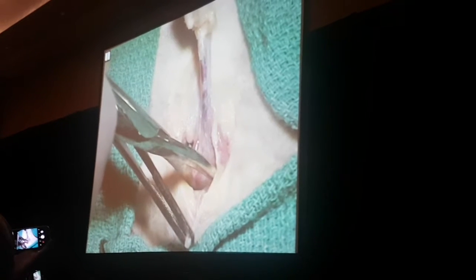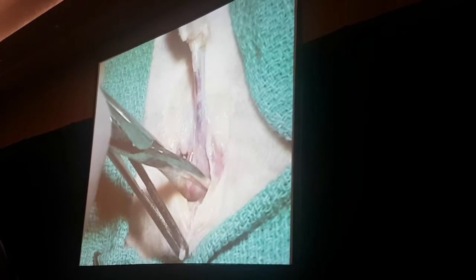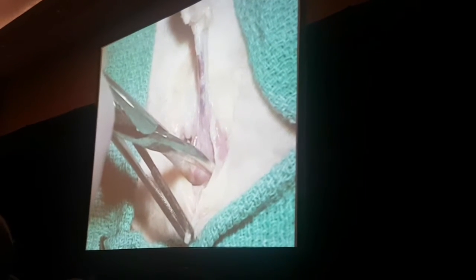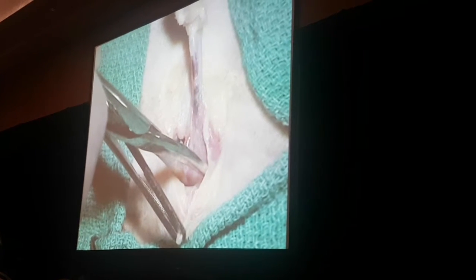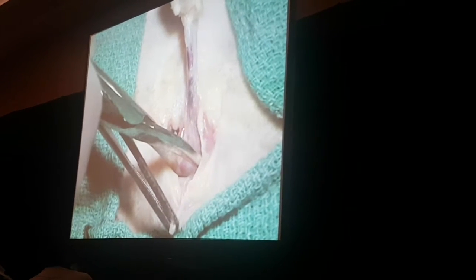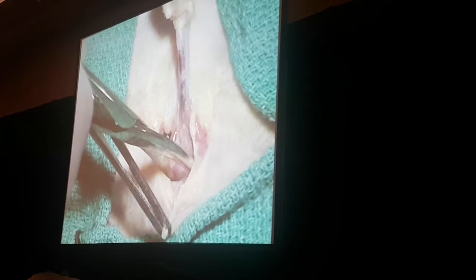Look carefully at his penis — look at the length of his penis. Notice towards the tip of his penis, his urethra is blue. In fact, in this case it's purple. That's the urethra. It's purple because it is vascular tissue surrounding the urethra. Notice how you follow it further up and the purple color goes away, because now you're getting into higher collagen density and you're getting into the pelvic urethra.